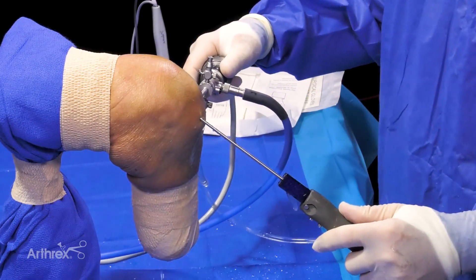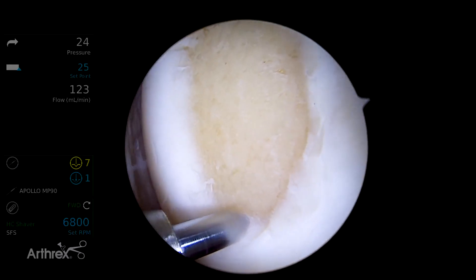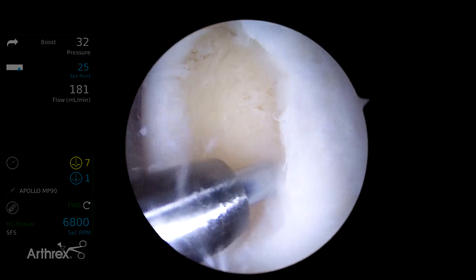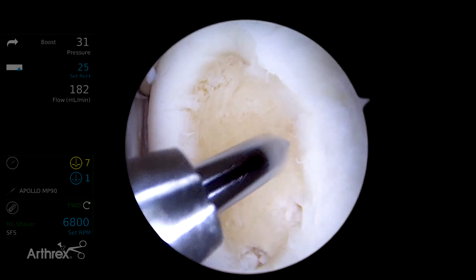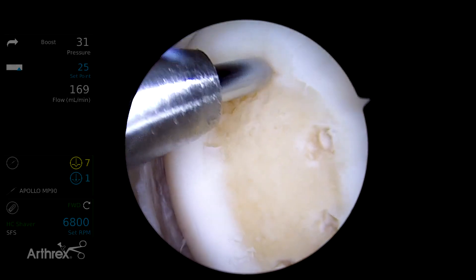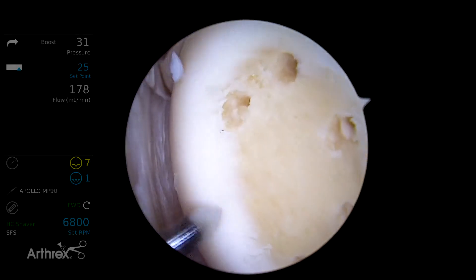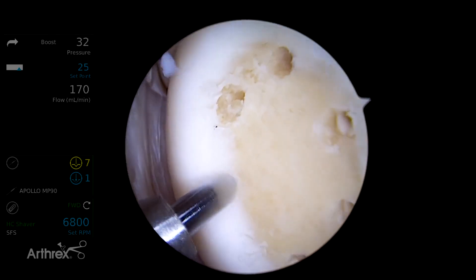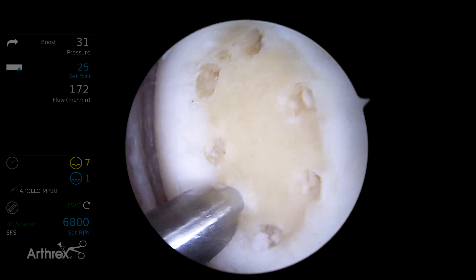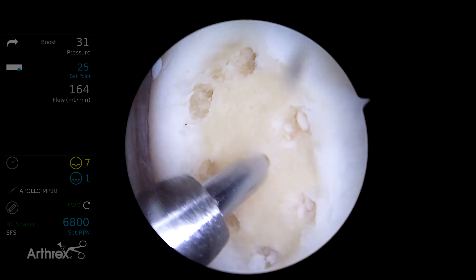A relatively small defect is probably a great candidate for marrow stimulation, or in this case, an autologous cartilage graft. We're going to do a standard marrow stimulation technique, which is very atraumatic. Using a PowerPic has no associated necrosis, it's very precise, there's no crack propagation. So the risk of subchondral stiffening, sclerosis, and cystic change — as we've seen by MRI — goes down significantly. The sole purpose is to stimulate access points to endogenous MSCs.